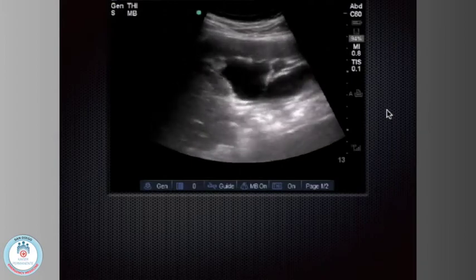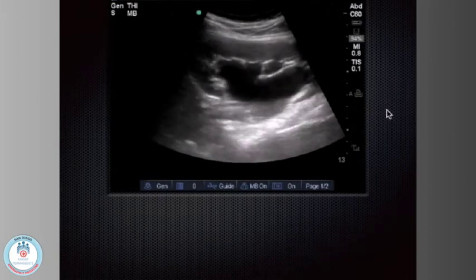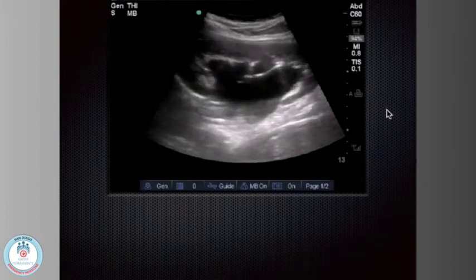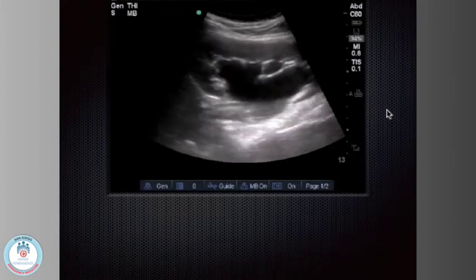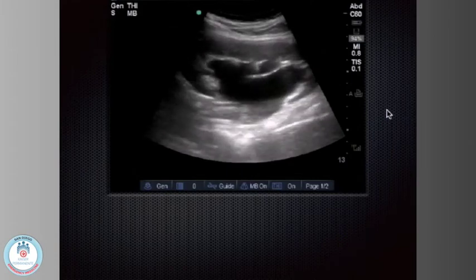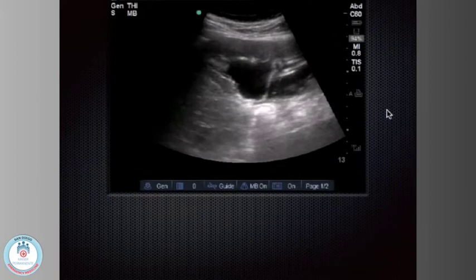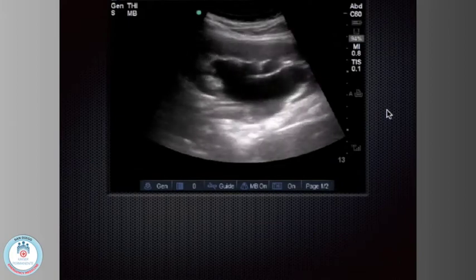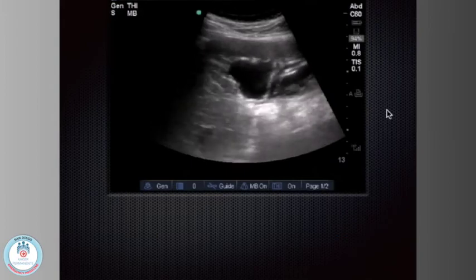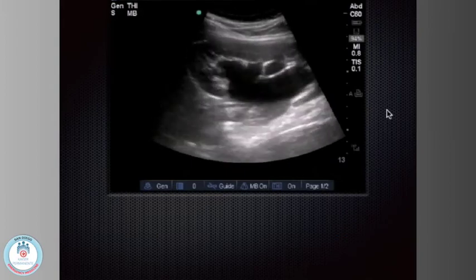Where's the hydro? This is like moderate to severe, maybe, once you start to see the cortex. First of all, if you can still make out the fingers of the glove, that's mild to moderate hydro. When all the fingers start to coalesce together like this, it's like a bear claw. Okay, does that make sense? Then that's more like moderate to severe. When you see the whole cortex get all squished up, just a very thin sliver at the top of the screen, that's really severe hydro.